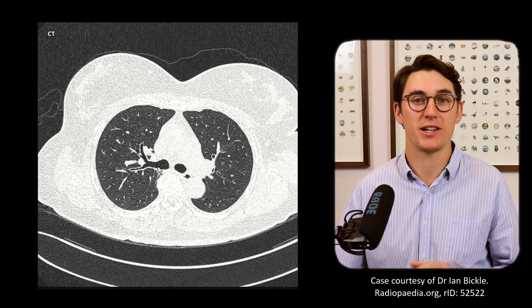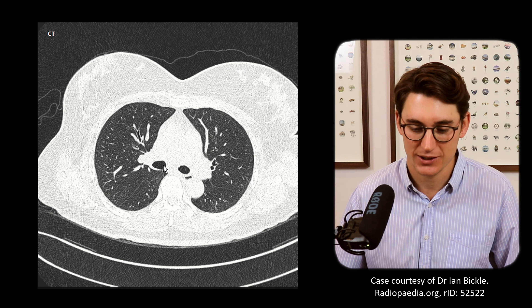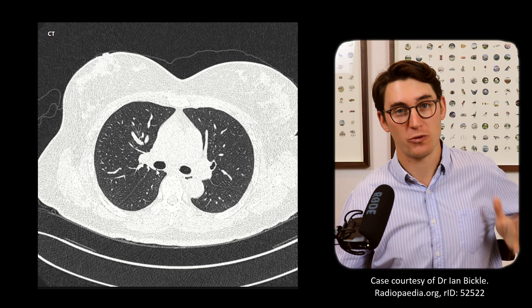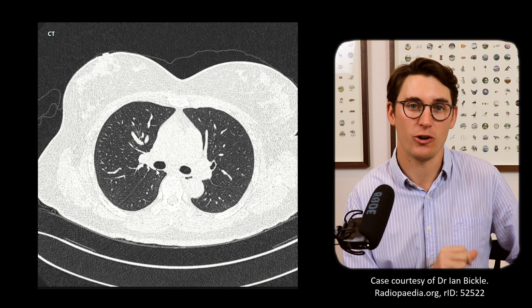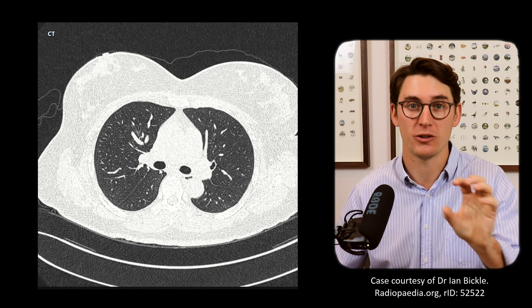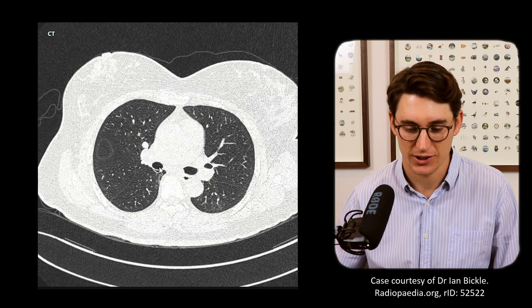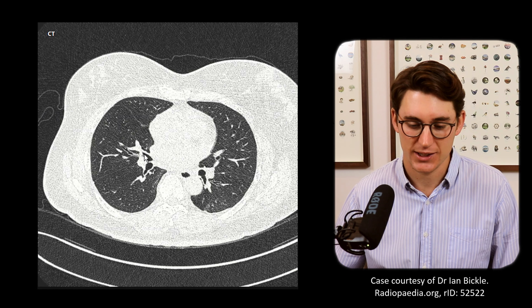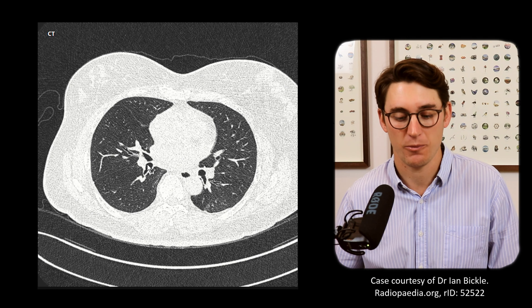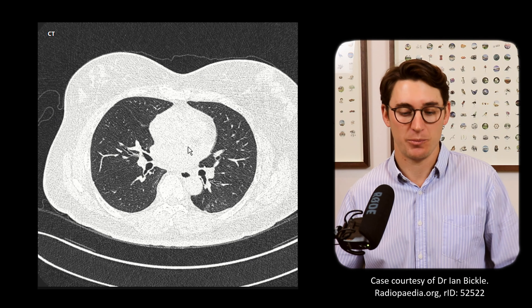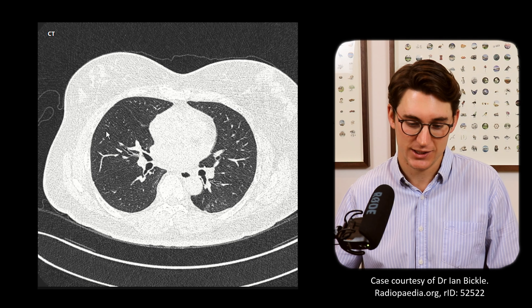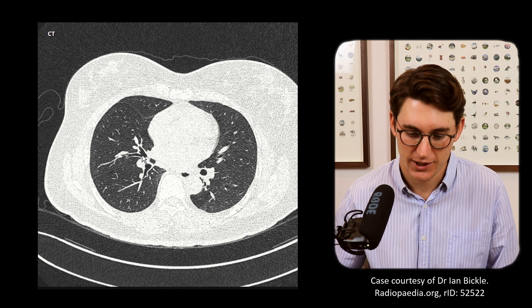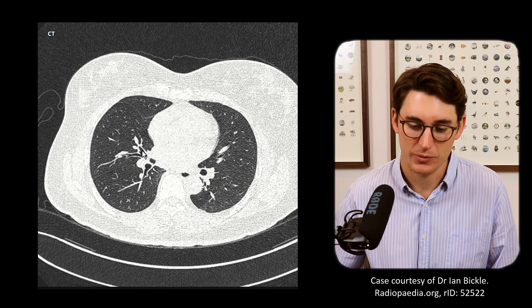The right main bronchus has now become our bronchus intermedius, which splits into our middle and lower lobe bronchi. Since the middle lobe is anterior and the lower lobe is posterior, we expect the middle lobe bronchus to branch off anteriorly. Scrolling down, we see the right middle lobe bronchus coming off, and because the middle lobe extends laterally we can identify a lateral and a medial branch.